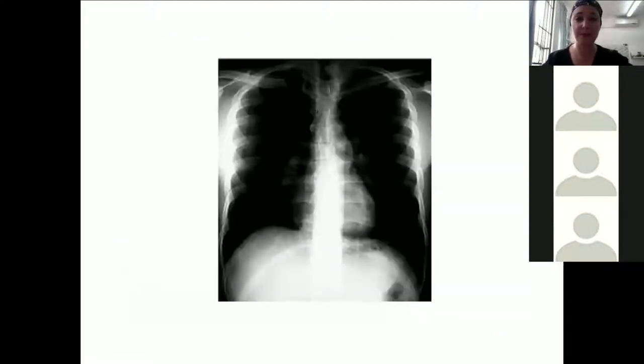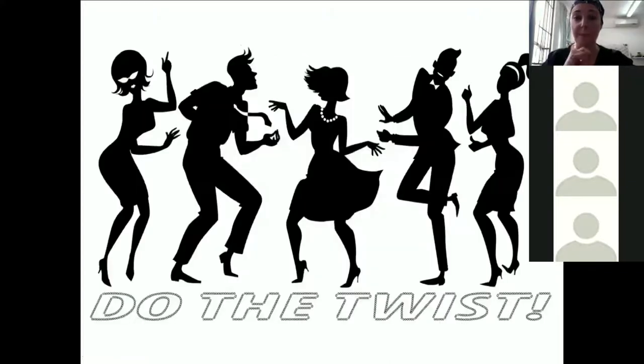And let's show you the opposite. This is an example of an x-ray that's completely overexposed. As you have a look at it, you can see it's just far too dark to really see much that's useful at all. So you want to be aware of what's underexposed and what's overexposed. Okay. Next question.